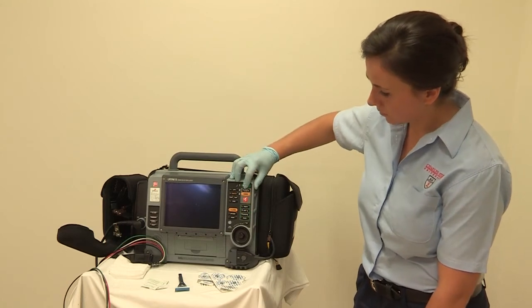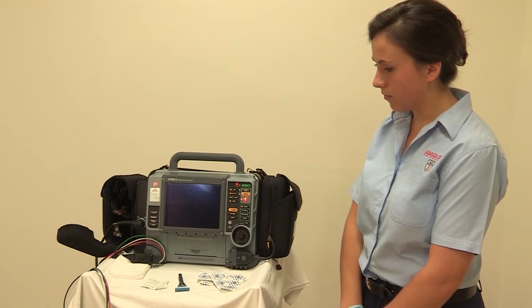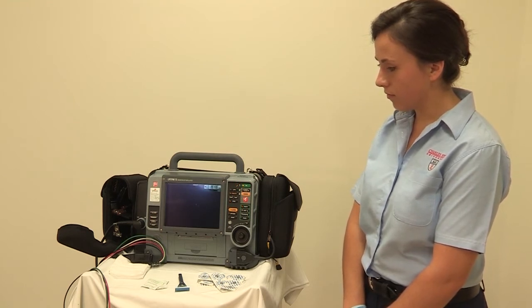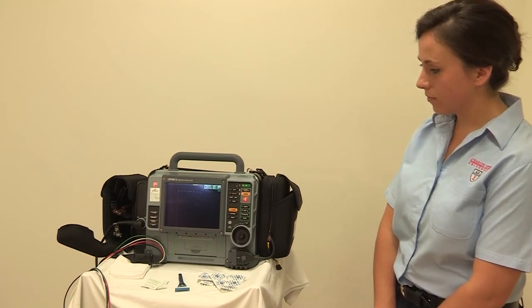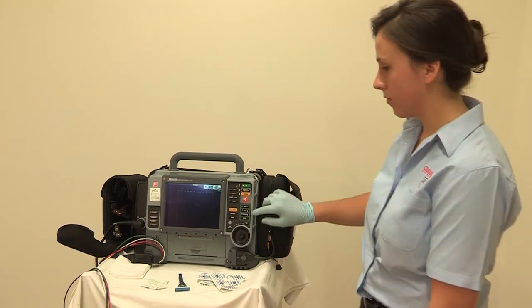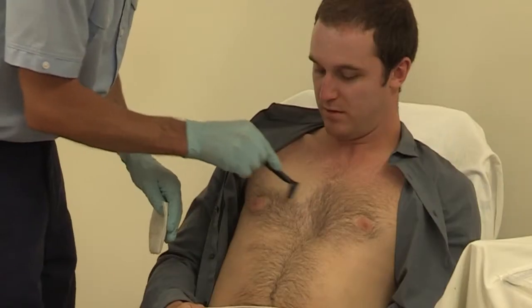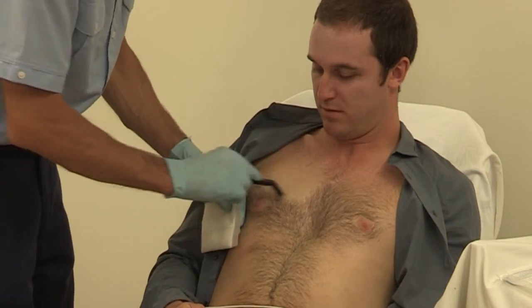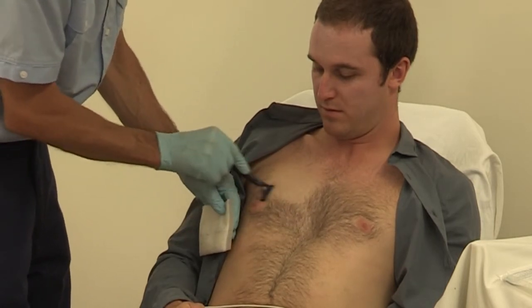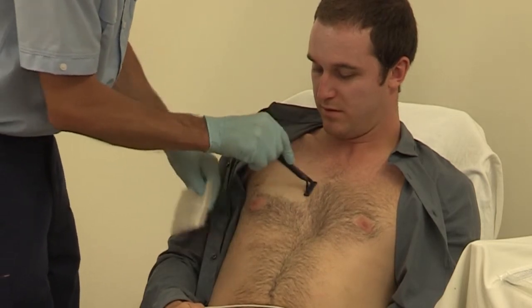Turn on your monitor. This machine is a LifePak 15, but we also use several others in the ambulance services, including LifePak 12s and the Philips MRX. You'll need to become familiar with how to put this into the correct mode for monitoring and the mode for cardioversion. You may need to prepare the skin first by either wiping it with some gauze or shaving it to allow better contact for the electrodes. You won't get a very good reading if you attach the electrodes on wet or hairy skin.